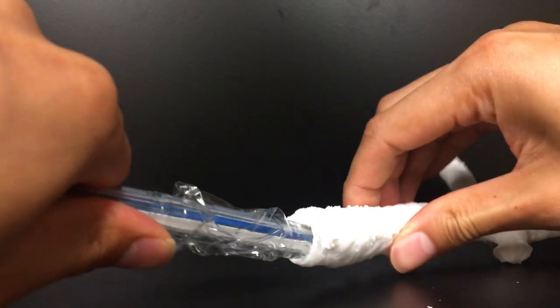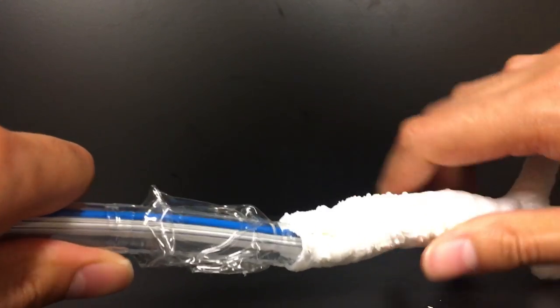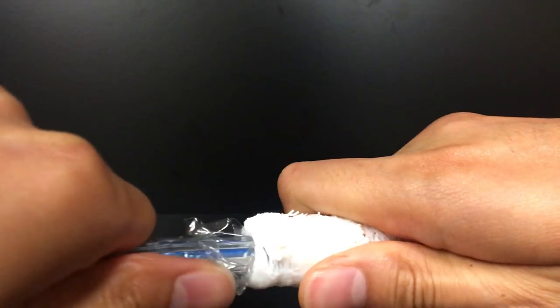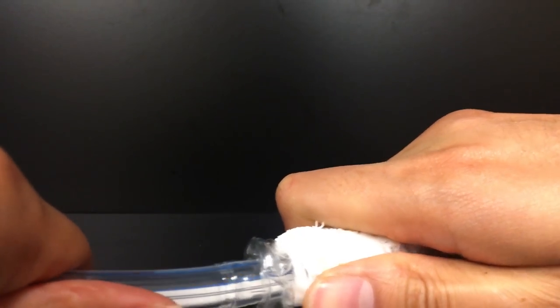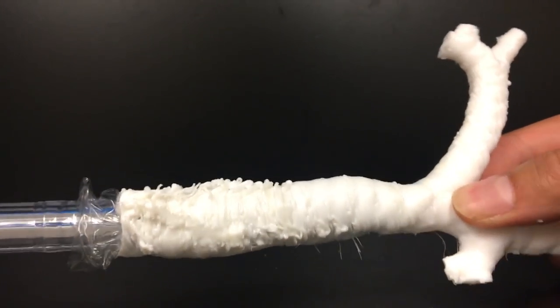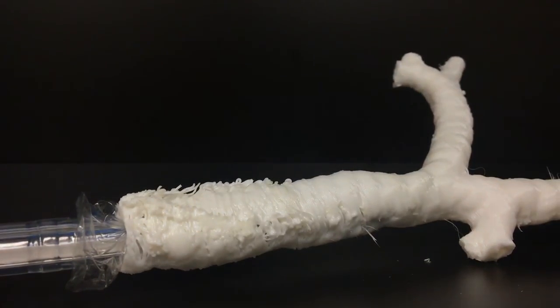There we go. So it's hard to tell, but this is actually expanding because it's an elastomer, and we can go all the way in with a 37. For this particular model, it gets stuck right here at the bifurcation. Ideally, oh my god, what a disaster.